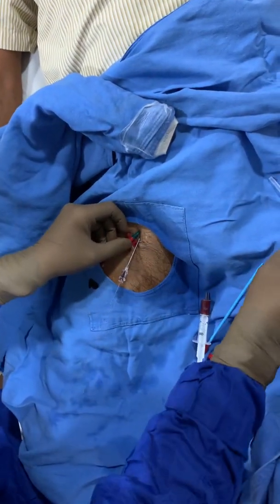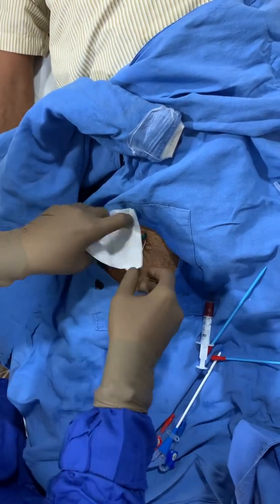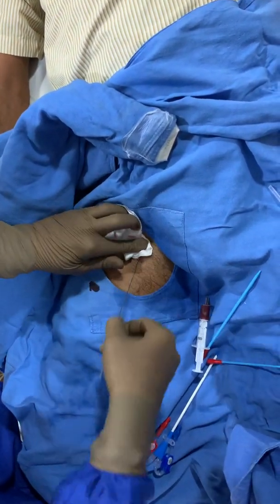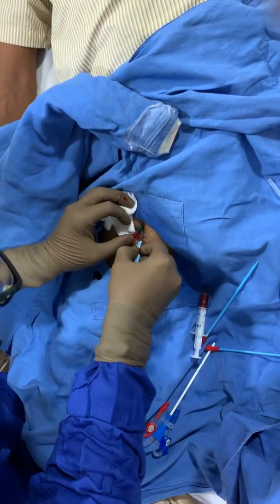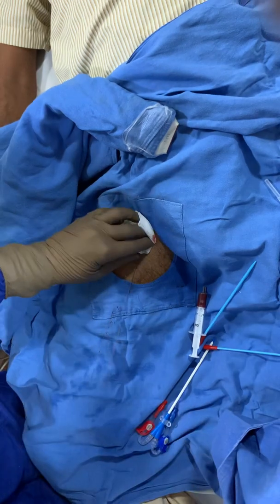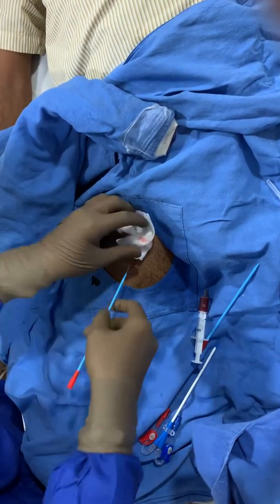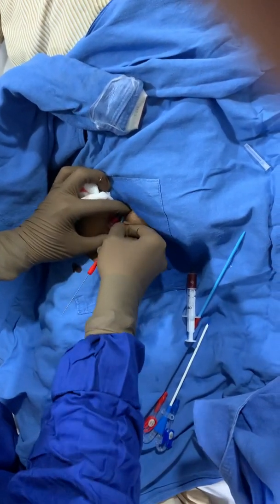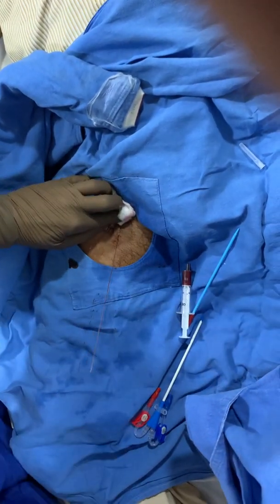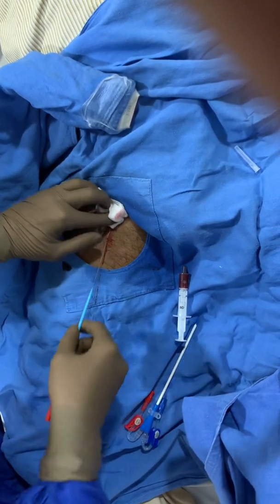I'll just use a slight nick prior to pushing in the dilators. A small nick will help them going down. This is the first dilator which I'm using, followed by the second, larger dilator.